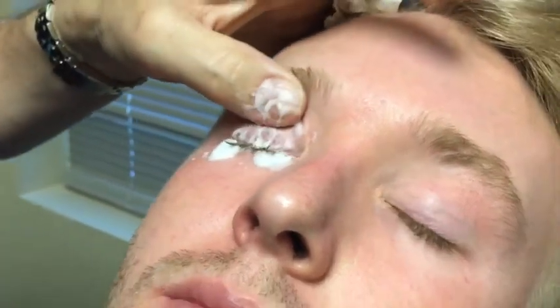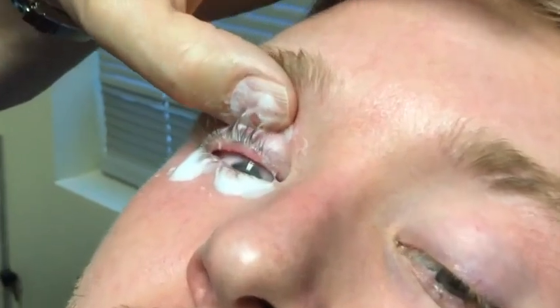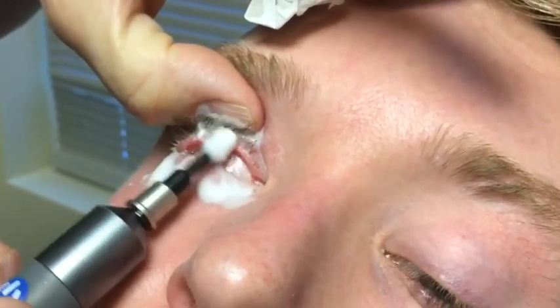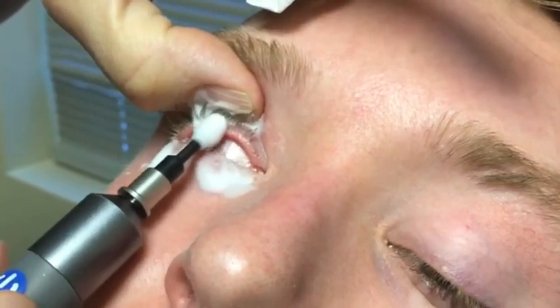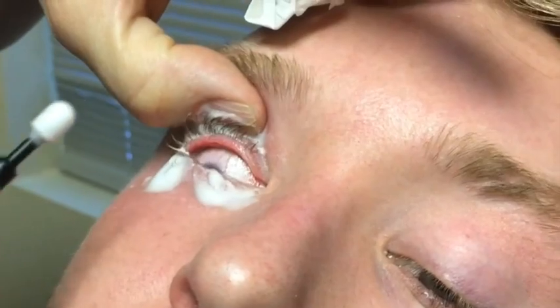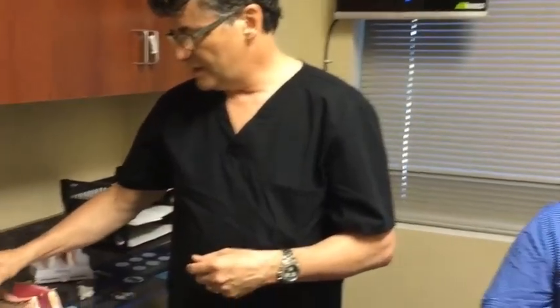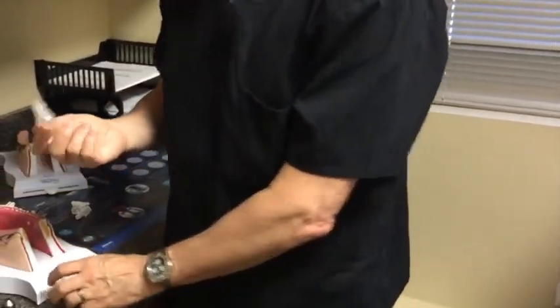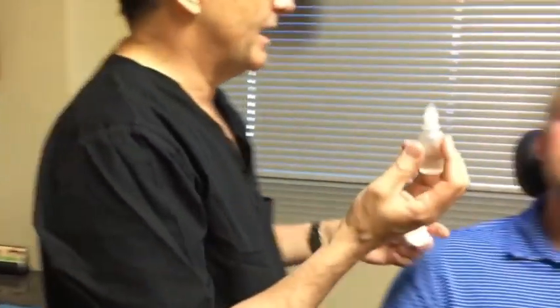So just to demonstrate one last time, I'm going to roll down and push in, and that pops the lid margin out so I can get the face of the sponge on the lid margin, treating my meibomian gland openings and treating lash follicles. All right, now we just finished that right eye. We're going to set the handpiece here before we take the tip out. Then we're going to turn to the patient and we're going to rinse this eye out.